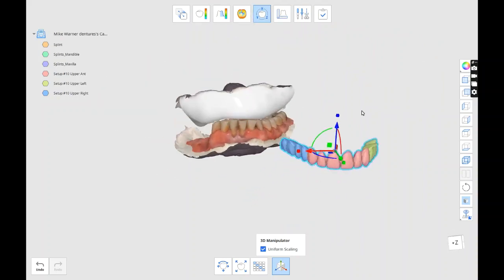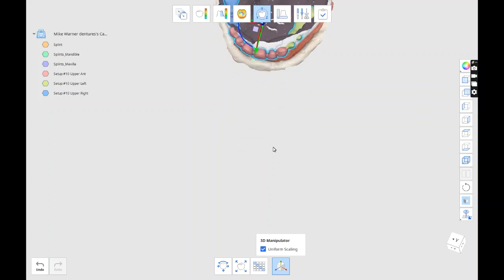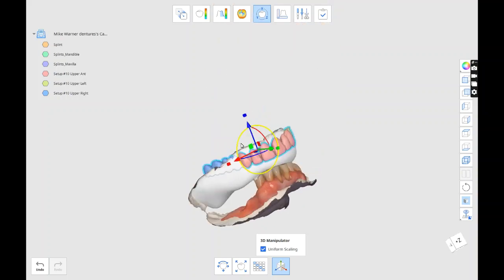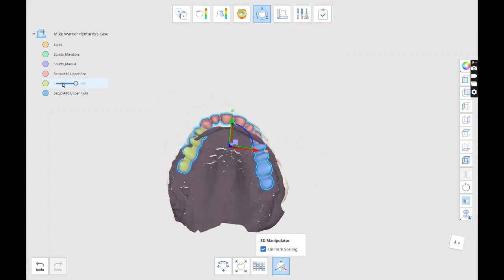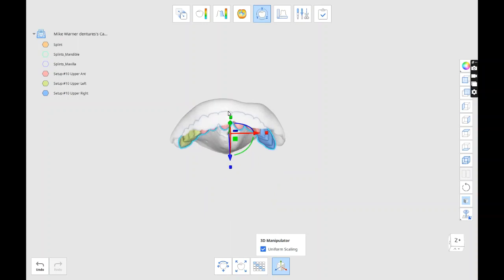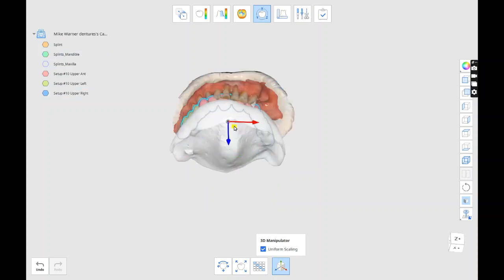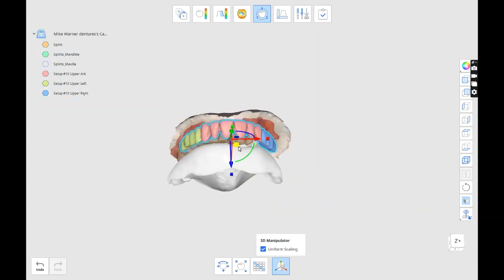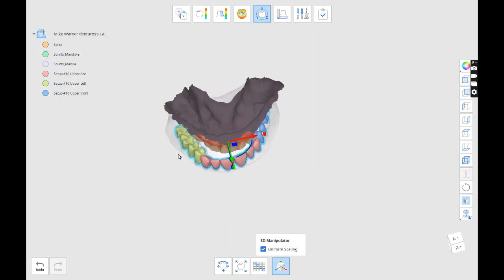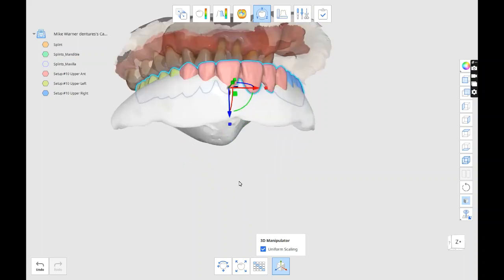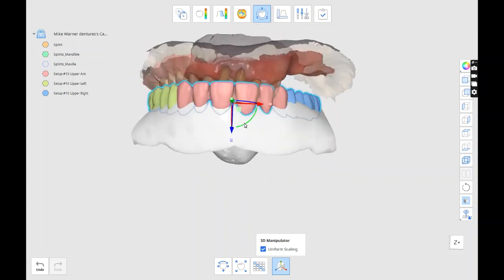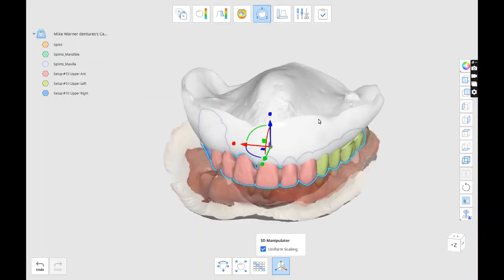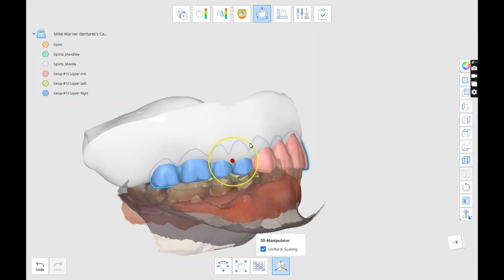That went really fast, but then I've gone in - I'm in Medit Tools now, and I've brought in the splint and the lower jaw. I just imported the teeth in segments, I've got an anterior segment and then the posterior segments, and then I'm going to manipulate them, move them, and orientate them.